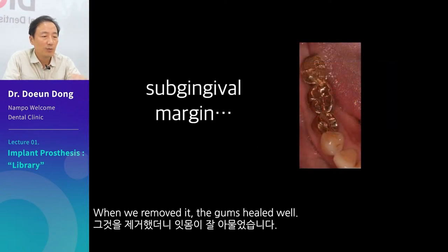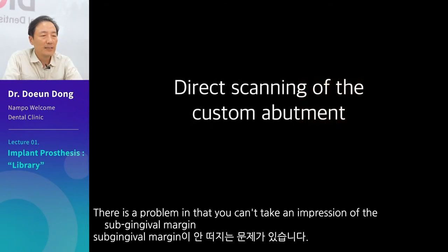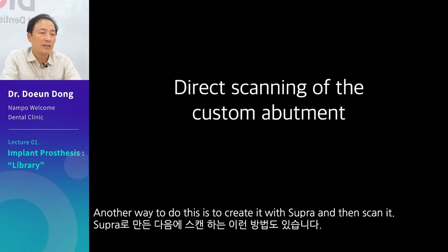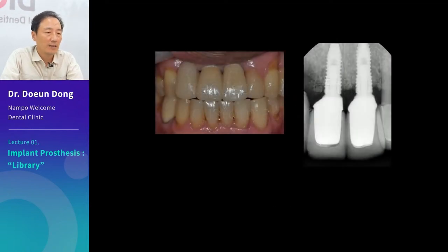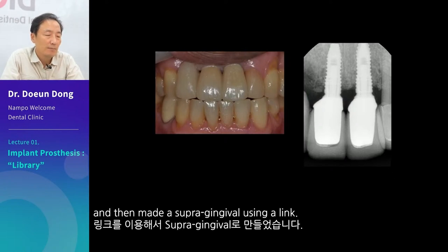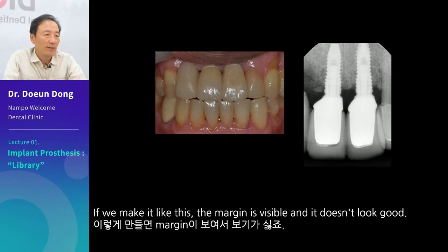There is a problem in that you can't take an impression of the sub-gingival margin. So, we scanned the custom abutment. Another way to do this is to create it with a supra-gingival margin and then scan it. As you can see, we made an abutment with zirconia and then made a supra-gingival margin using a link. If we make it like this, the margin is visible and it doesn't look good.